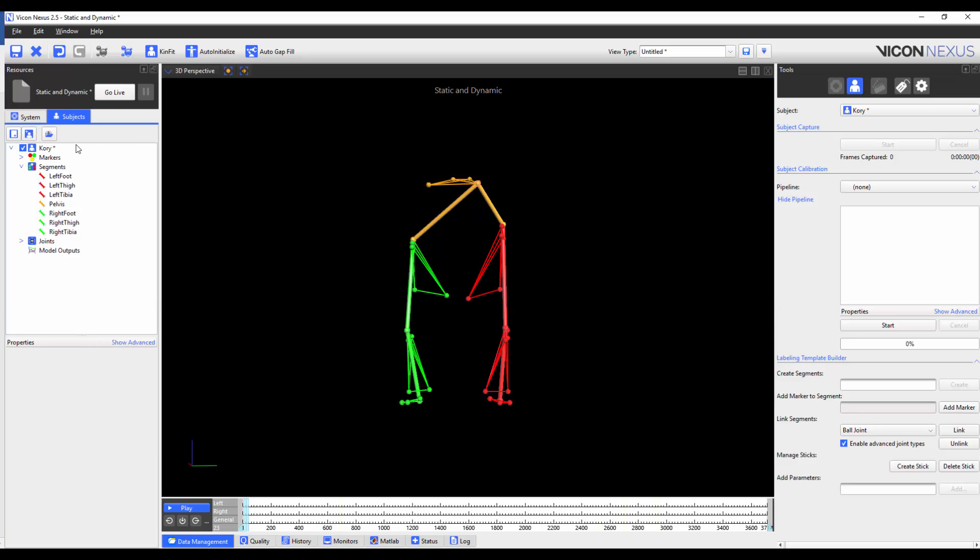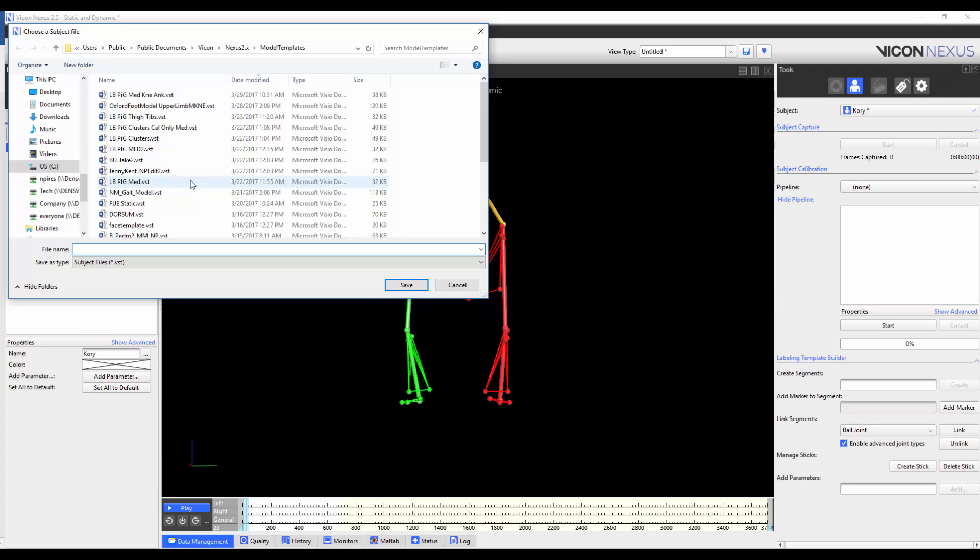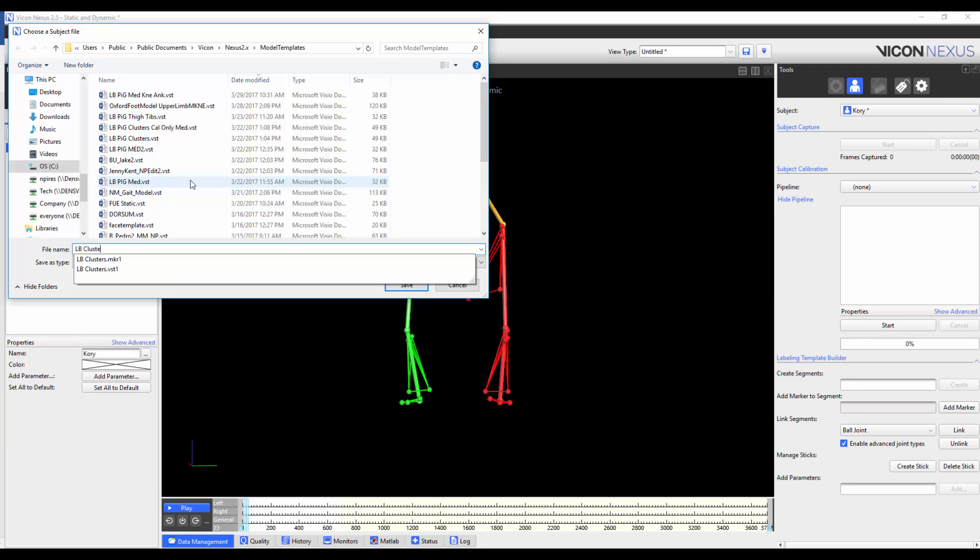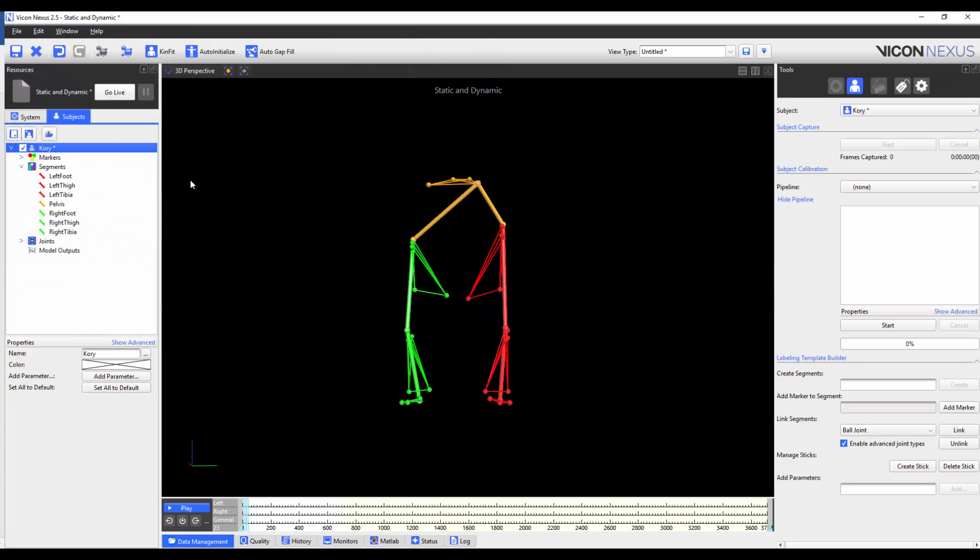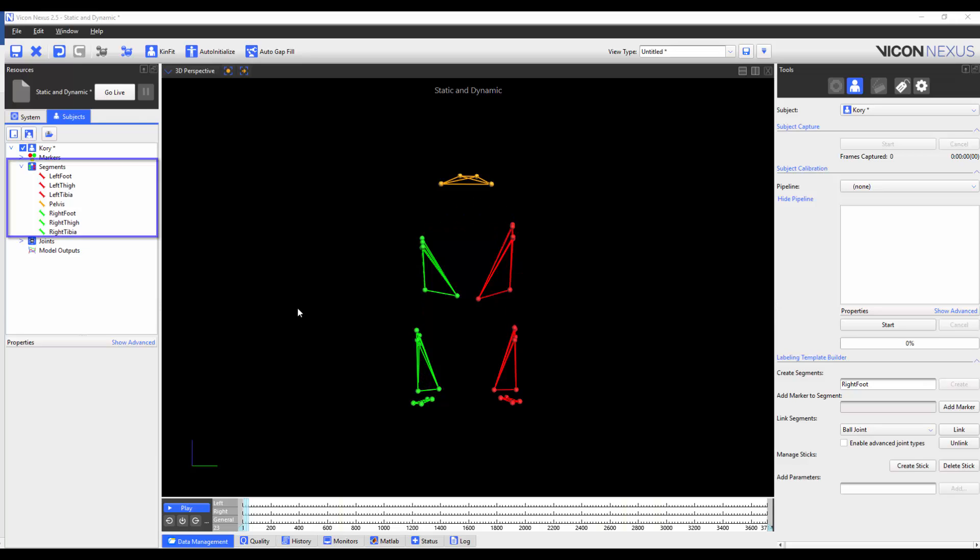To do so, I'm going to right click on the subject name and save labelling skeleton as template. In this case, I'm going to call my template LBClusters. It's worth noting that I build all the segments on the same frame. In this frame, all of the segments are calibrated and so I can link them. If I move to a different frame, the segments are no longer calibrated and so I won't be able to link them.